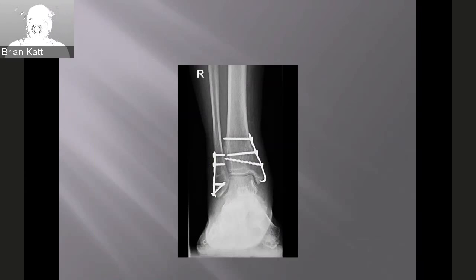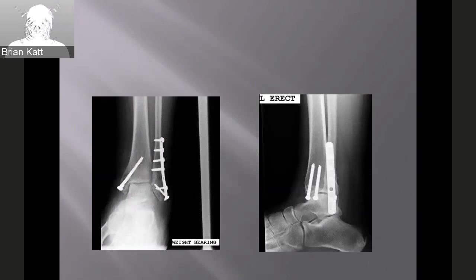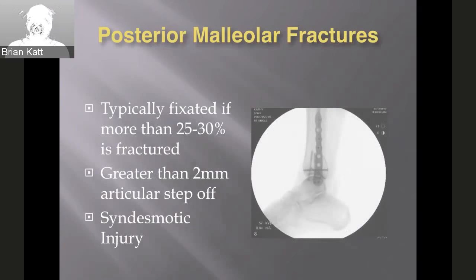Plate fixation can be utilized to prevent dorsal translation of these fracture fragments, whether it's through this hook plate or through a 1/3 tubular plate that you bend and contour to the fibula. And here's just an example of some fully threaded screws, but it's traditionally more of a 4-0 cannulated screw, long or short thread based on the fracture pattern, used for fixation.